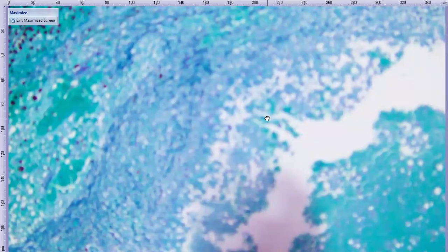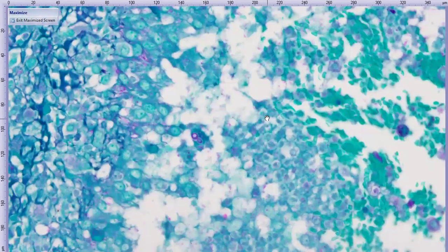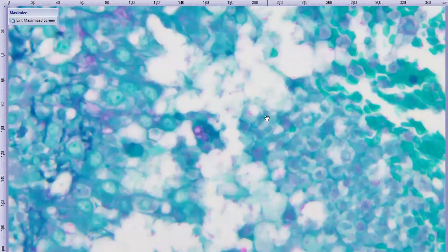So this is pretty much a clear-cut diagnosis. Did you say narrow-based budding? I did not specifically say narrow-based budding, but yeah, that would be an example of narrow-based budding. Okay, we don't usually see that. So that's part of the reason why the panfungal PCR was nice to have. But yeah, okay, we'll stay back on that.